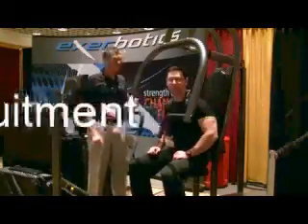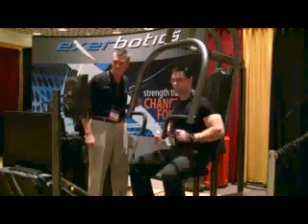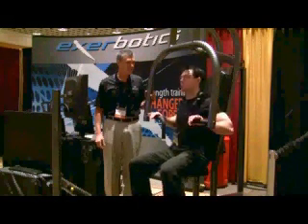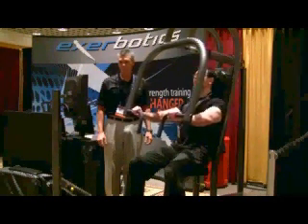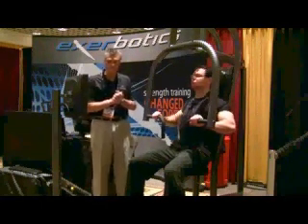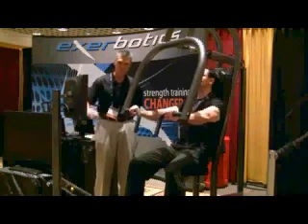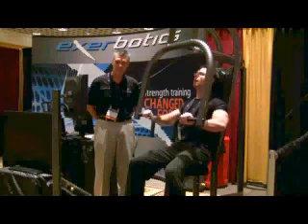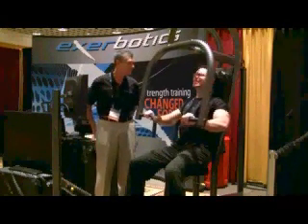I'm going to try a few reps and let's see how it goes. We've already set David's range of motion up here, so we'll go ahead and start the machine. It'll come back and rest for about three seconds, and then David can get out. The machine automatically adjusts to David's own biomechanics and the strength levels. He's getting immediate feedback on the screen.